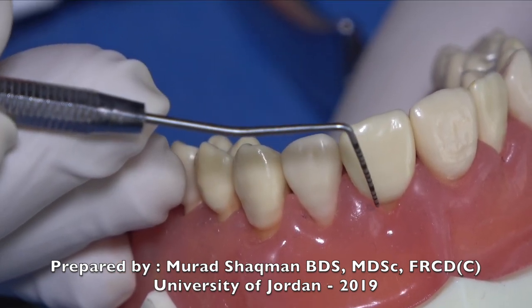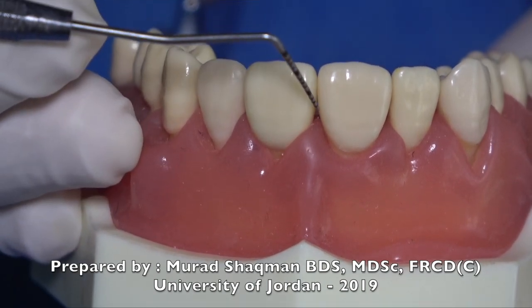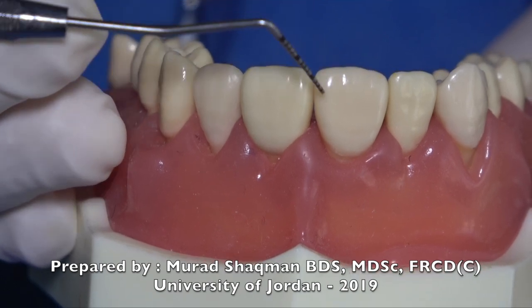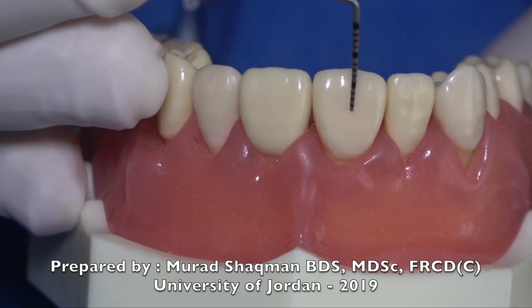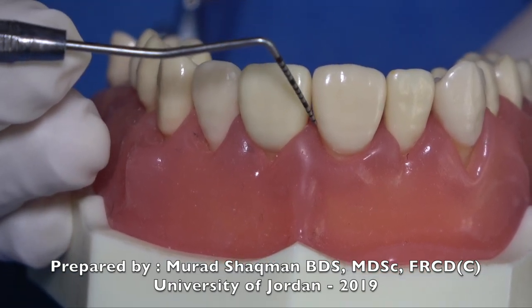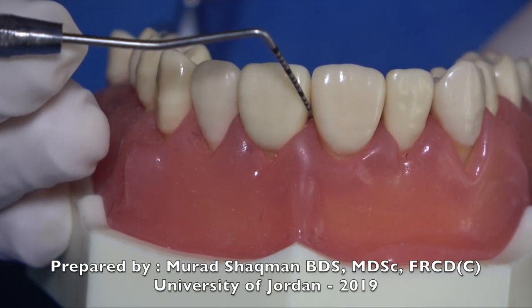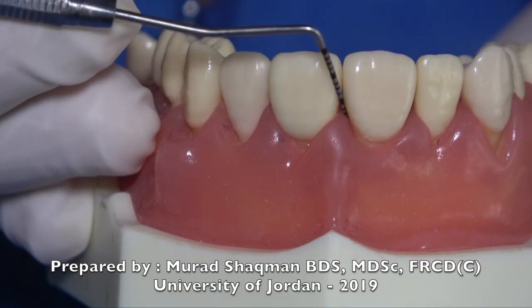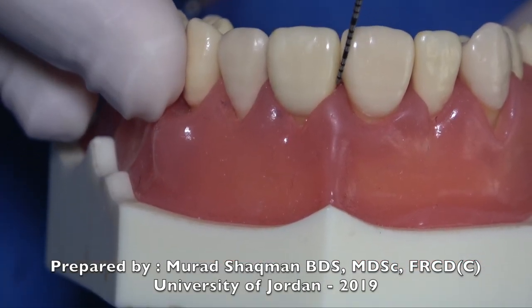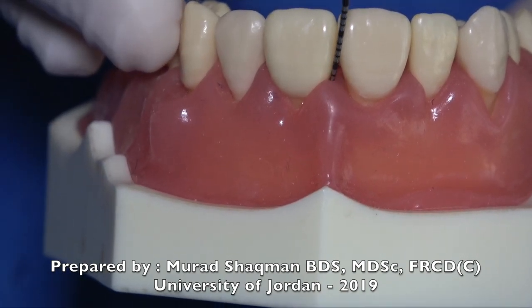When probing the right central incisor on the mesial, don't hold it straight — tilt it so the first two millimeters of the probe make contact with the tooth and are flat on the surface you're probing. When switching to the adjacent central, switch your angulation accordingly.